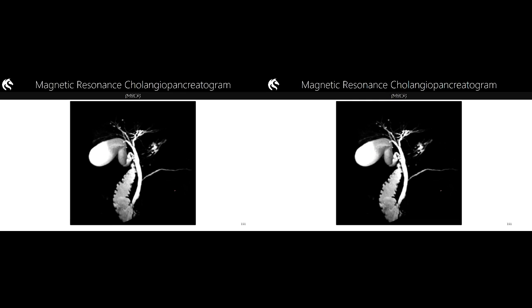And last one, an MRCP, a magnetic resonance cholangiopancreatogram. Very, very pretty, not done very often at the moment, but if you have got a patient who is magnet friendly, that can be quite a nice way of imaging them. But at the moment, fluoroscopic studies are by far the most common way of imaging the hepatobiliary system, both intraoperatively and fluoroscopically. Any questions about any part of that material for today?